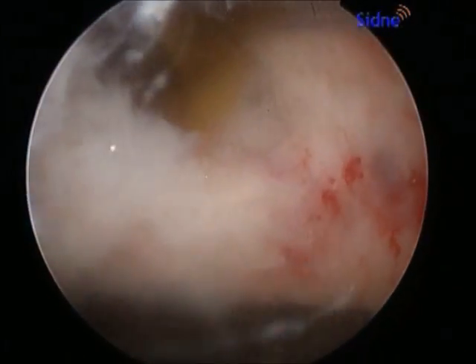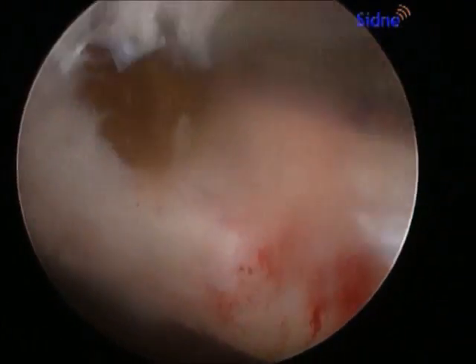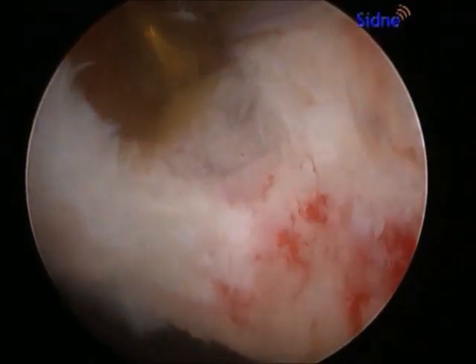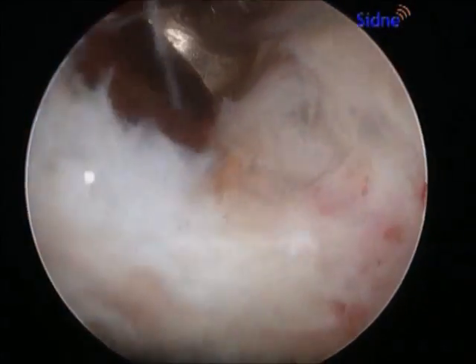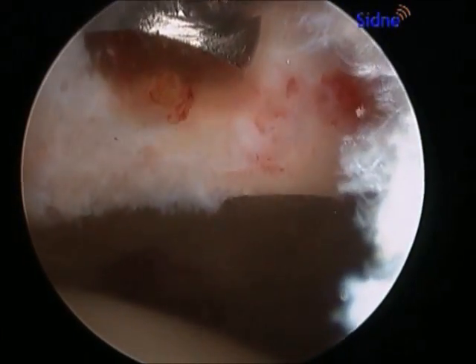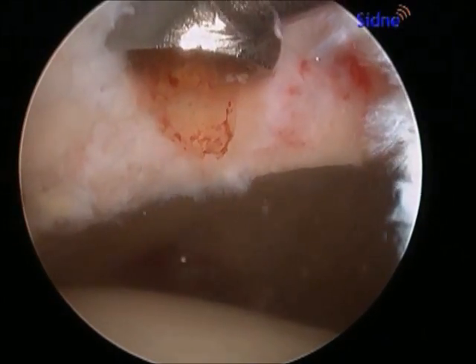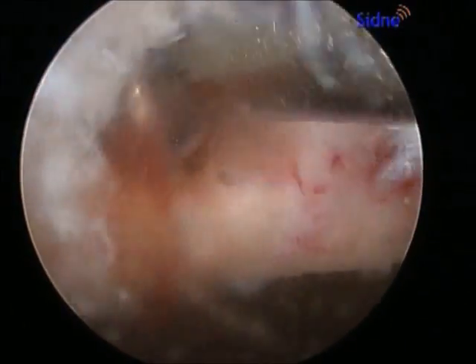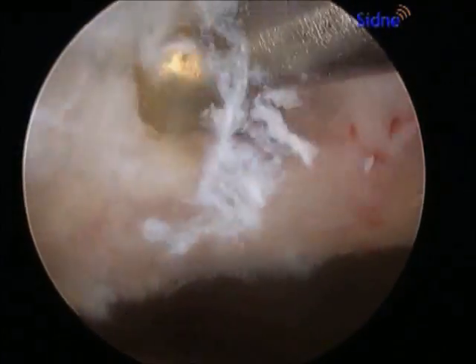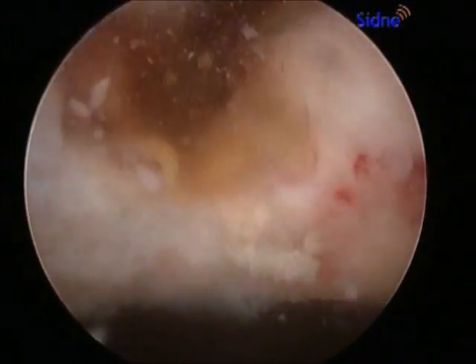A curette is introduced into the cystic area of the acetabulum and the yellow material that makes up part of the cyst is easily seen. The soft tissue invasion about the bony area of the acetabulum creates a large cavity where bone remodels away from the cyst, and this can be a source of pain in people with early arthritis of their hip and also with hip impingement.